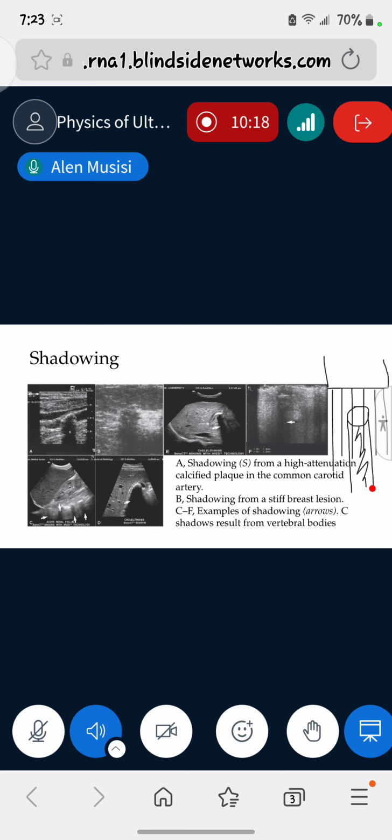But for spatial compounding, the transducer will be made in such a way that it also sends beams in other directions like that. This is what we call steering of the beam, and it also steers them on another side like that. So you realize that some of the beams will go around the structure to reveal the structures which were initially in the shadows.